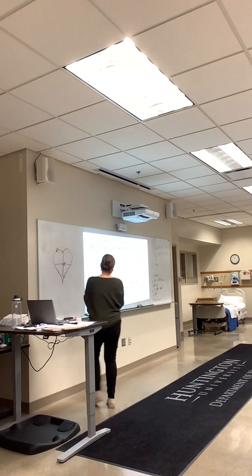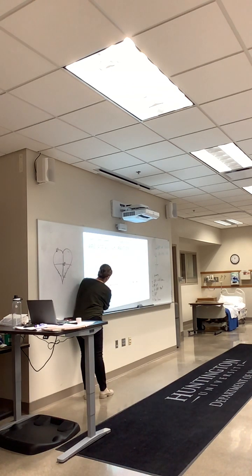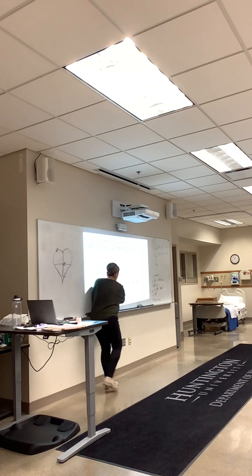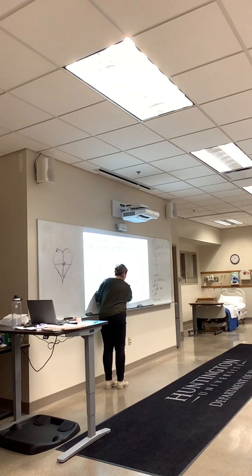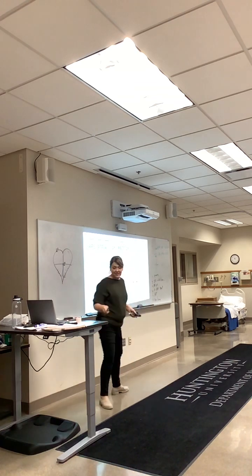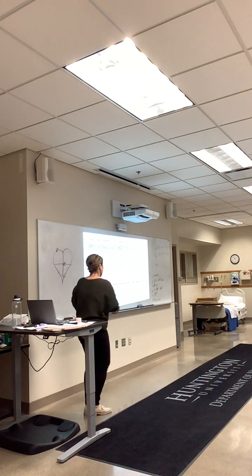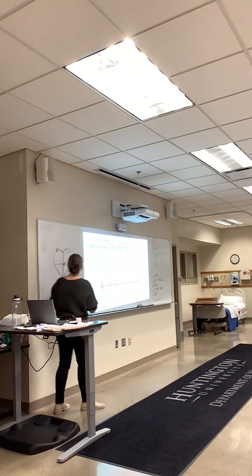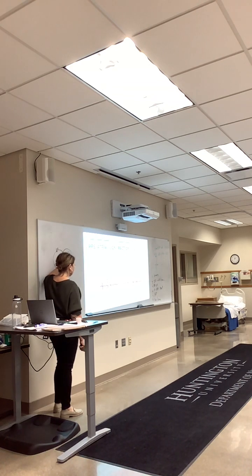No. My PR interval is here, that's about 4 boxes, somewhere in there. Okay, that was a weird one. We got normal here, but this one goes way beyond normal. What's happening here is I have my SA node firing. Cool. There's something going on in my heart.